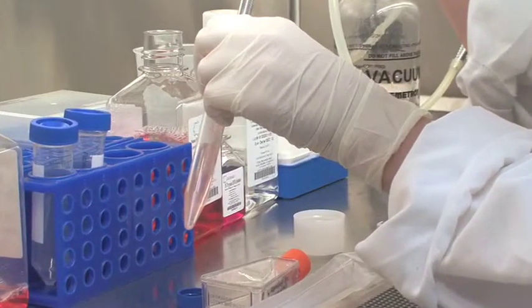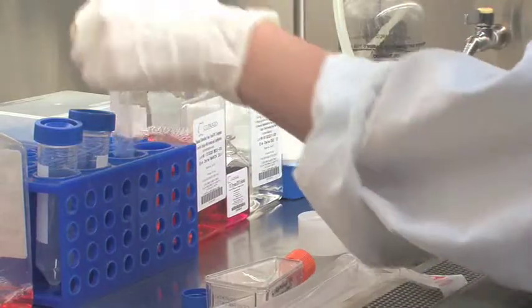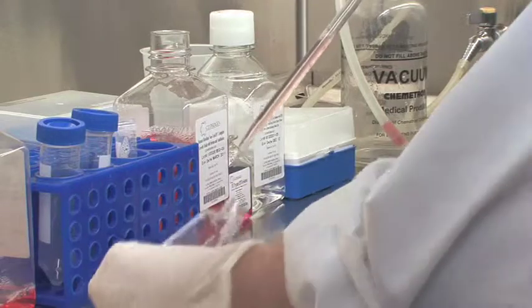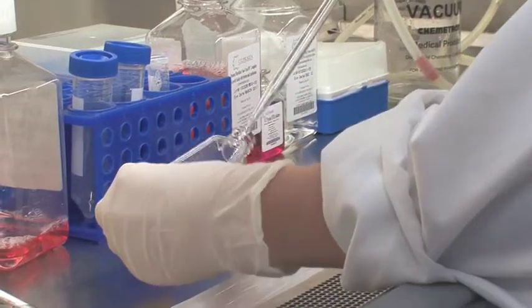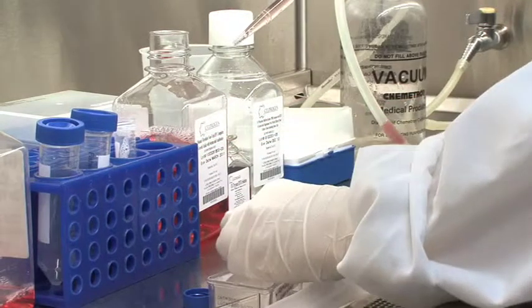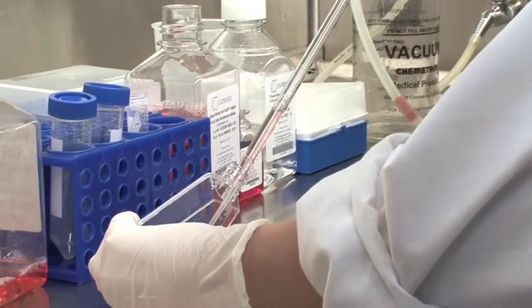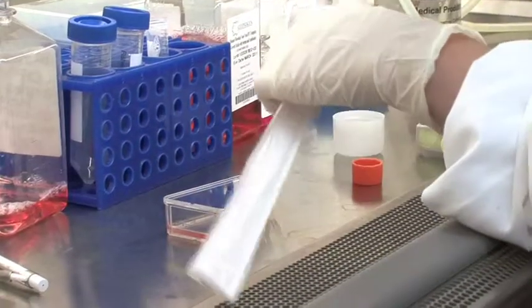Reconstitute cells in 10 milliliters of the complete growth media. Note, in the T25 version of the protocol, use 7 milliliters of the complete growth media. Transfer 10 milliliters of the reconstituted cells into a pre-coated T75 flask. Note, in the T25 version of the protocol, transfer 7 milliliters of the reconstituted cells into a pre-coated T25 flask.